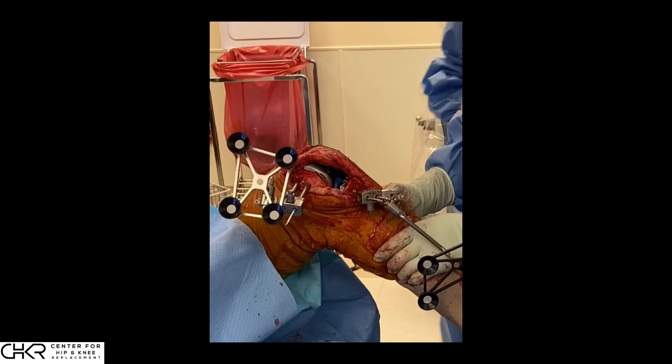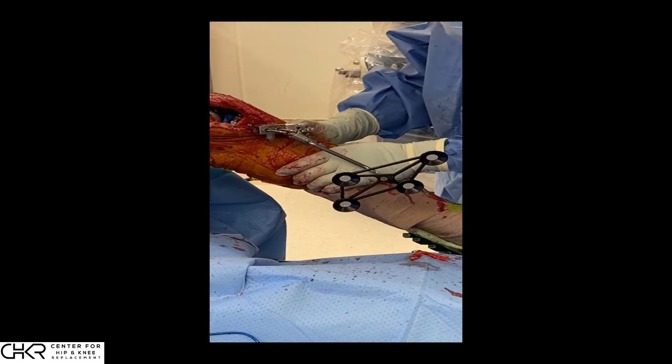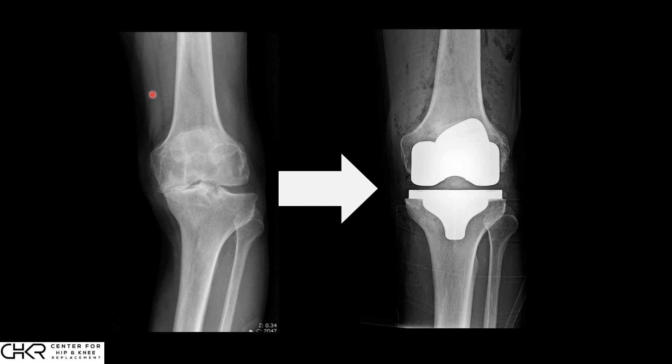Once the posterior cruciate ligament is balanced in the flexion plane and we have created a symmetric gap, we take the knee and the trials through a range of motion. Specifically, we ensure there is not excessive posterior translation — we apply a backward force on the tibia and confirm it does not displace relative to the femur. The quantitative measurements allow us to go from a deformed varus knee to a stable, balanced, well-aligned knee with a symmetric joint space clearly restored to neutral position.